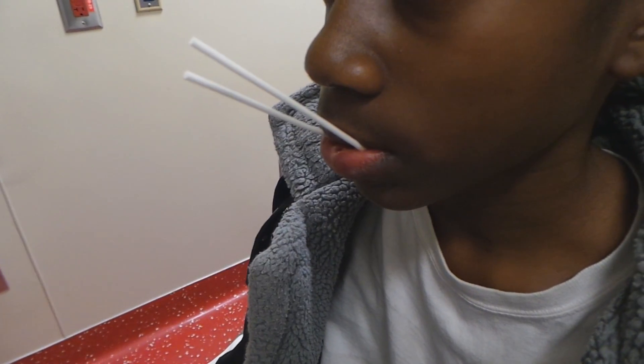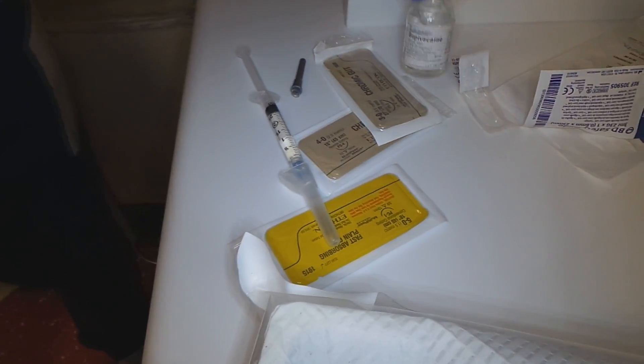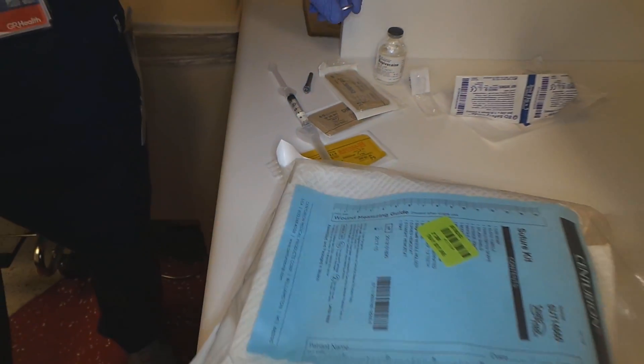We're numbing him up so he can have a painless injection. We're using bupivacaine — correct? Correct. 0.5%, without epinephrine. All right, so let's go ahead and get this done.